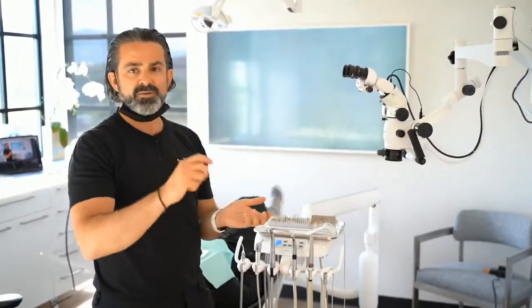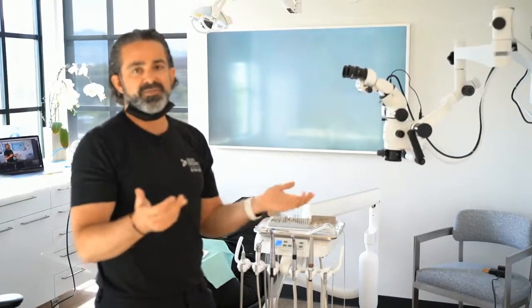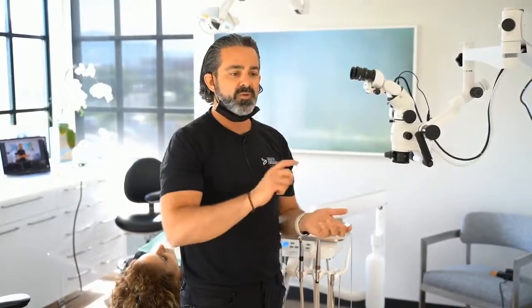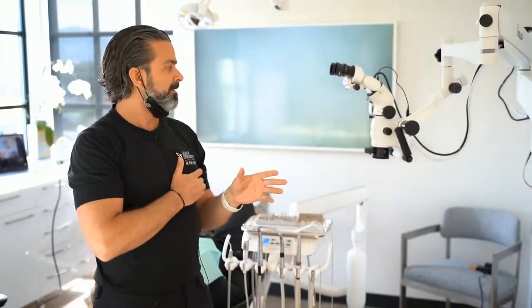And so I like those incremental steps because I kind of tailor it for what the job is. Pulpal floor finding, high, but if I'm doing a filling, then it's lower. So it's really important to have that. If you're at a 3-step scope where the jumps are really big, then really the talking point is you're just parking it in one lane and staying in that lane, which isn't as fun.